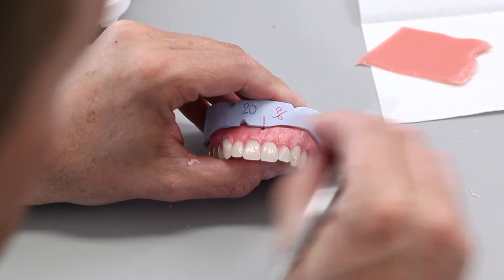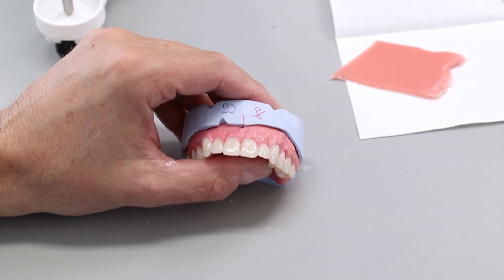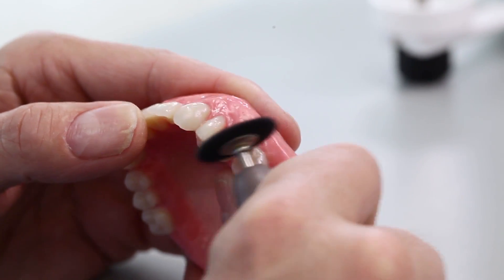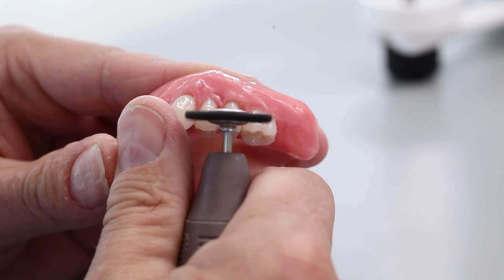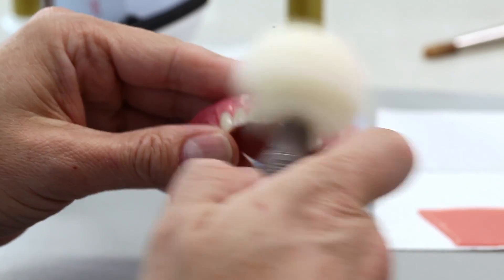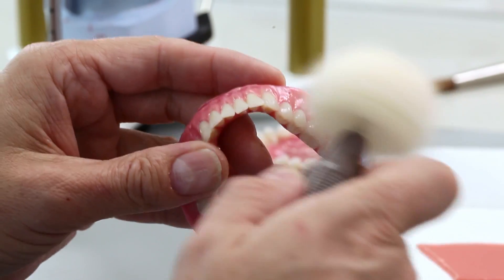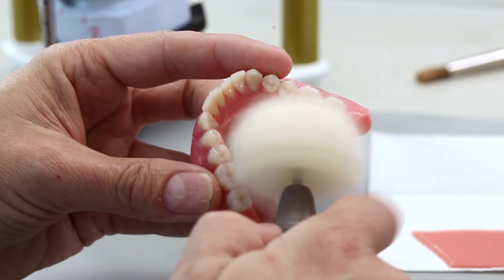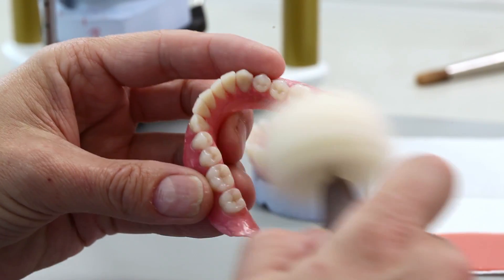The gingival design should correspond with the completed work as closely as possible. Our tip: use a synthetic hairbrush to remove wax residue from the teeth. Polish the wax to a high gloss using a foam polishing pad. A polished surface is pleasant for the patient and simplifies the completion of the denture later on.